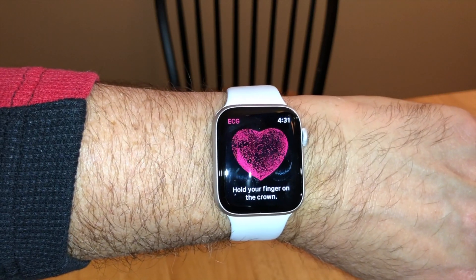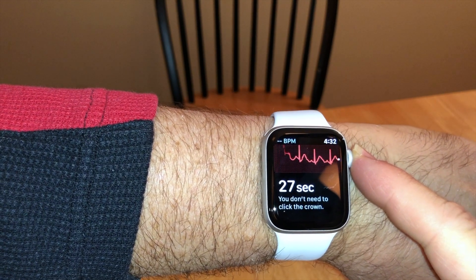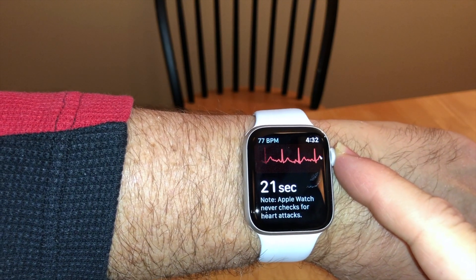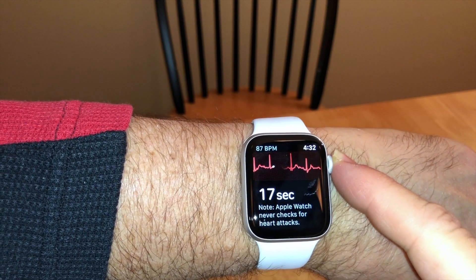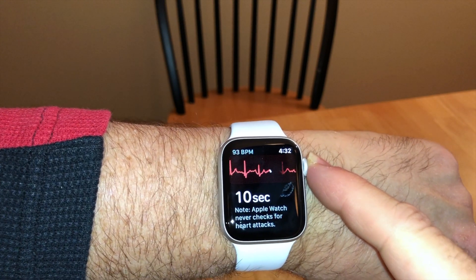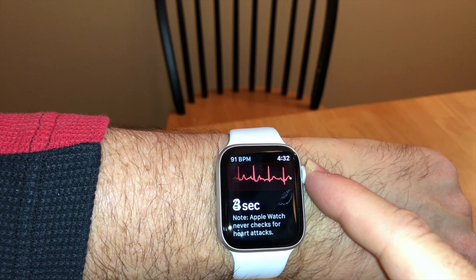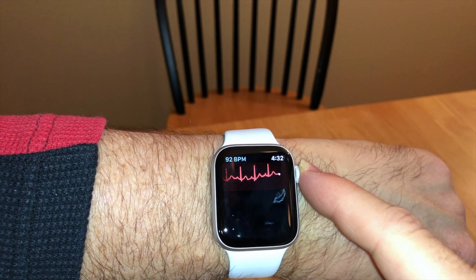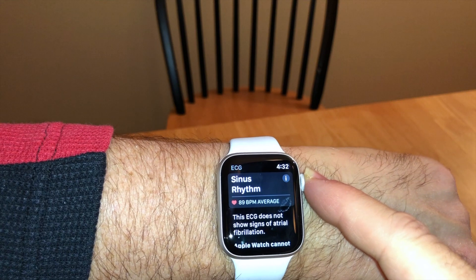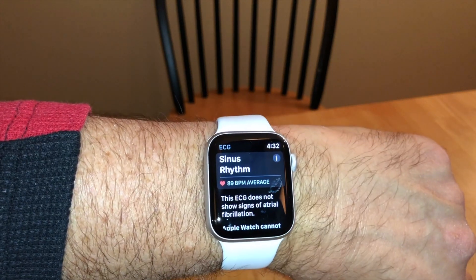Now we're in the ECG app. It's telling me to hold my finger on the crown — you don't have to press it, just hold your finger there for 30 seconds. You want to relax as much as you can and keep your arms on the table for the best result. I've done this two times already and got good ratings. There we go — it says sinus rhythm, does not show signs of AFib, so I'm good.